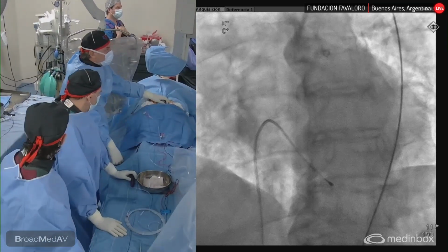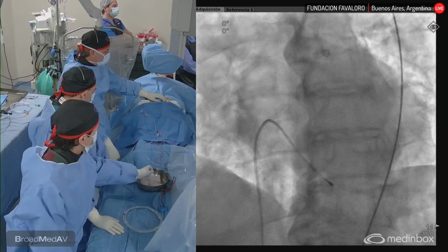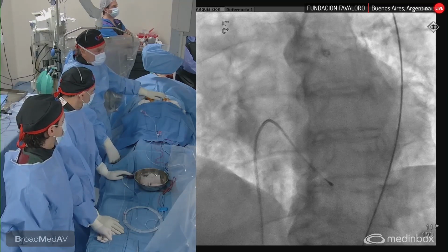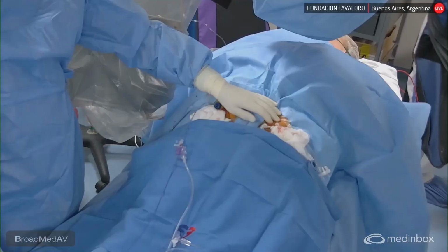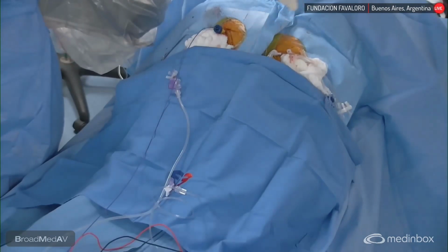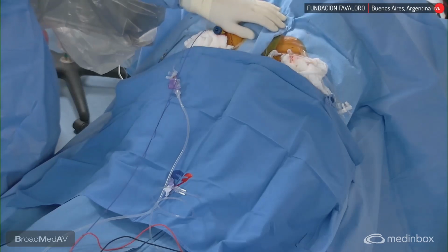I was speaking with Dimitri from Sao Paulo, who said that in most of their cases they use the radial approach. We still use the contralateral access, especially in obese patients, to check that we don't have bleeding in the main access, and then also to solve it if we have bleeding. Radial is safer, I know, but if you have to fix a problem, you have to do the puncture and then heparinization, or it becomes an emergency. And this is why there is a little discordance between different teams. Some still use contralateral, some from below, another from radial.